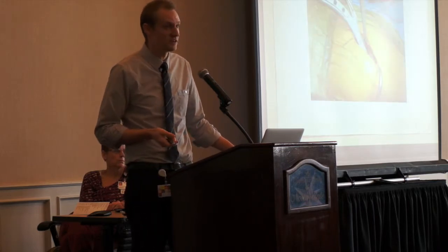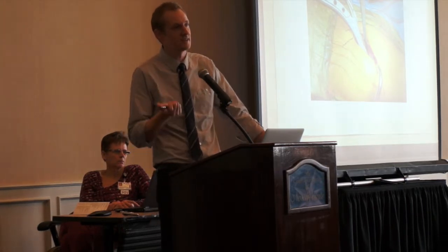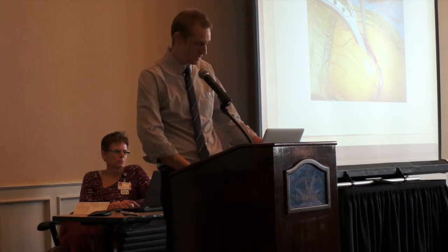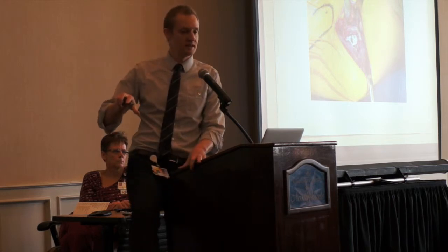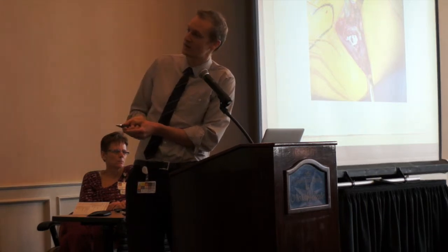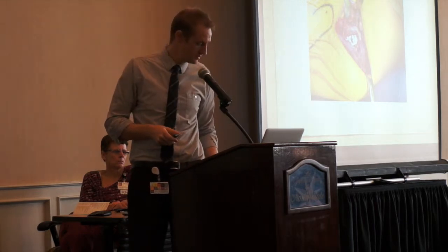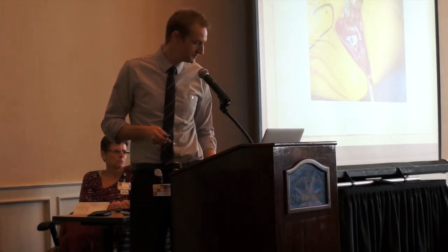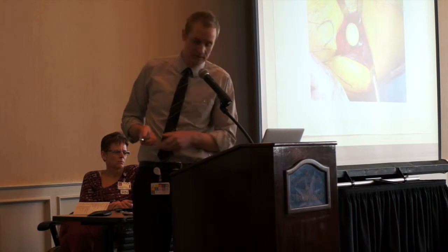The next slide is where we're preparing the proximal femur. You can see the metal hook here. That's hooked underneath the femur, and it elevates it right out into the anterior wound. And this is the broach handle, how we prepare the femur. Again, this is looking on end. The femur is turned 90 degrees, so we're looking down the femoral neck. What you see here is bone and the broach that's inside the femur now. So there's not a big field of view. All you need to see is the top part of that neck cut. And next, that's the final implant in position with a ceramic head.